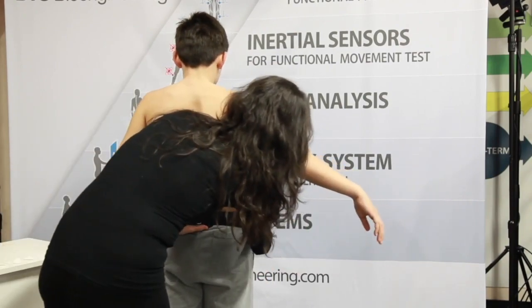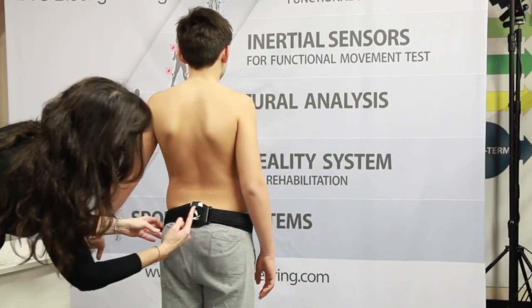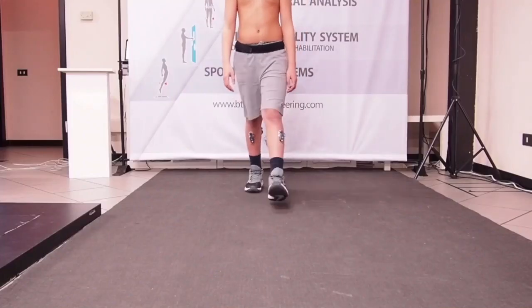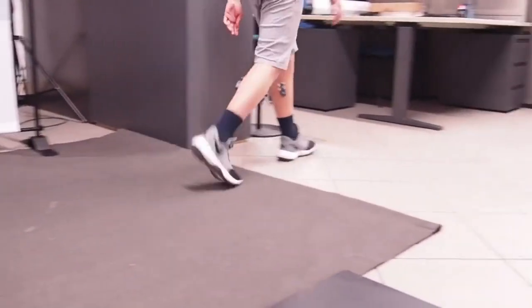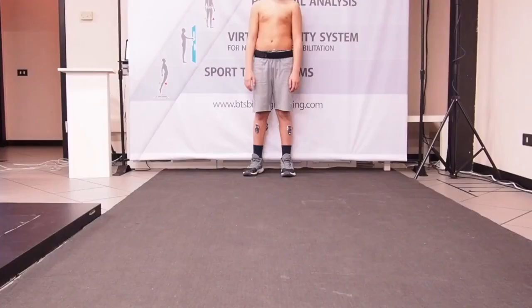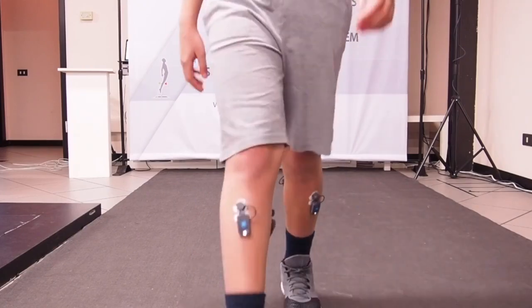It's very important that the sensor is aligned with the axis of the spine and that the upper part of the sensor is at the same time parallel to the line connecting the two dimples. For the test, in each trial the gait must follow a straight path, and it's important that at the end of the path the patient stops without rotating. I also remind you that it's always necessary to give the patient the command to start walking only after having performed a short initial phase during which the patient stands still in orthostatic position.